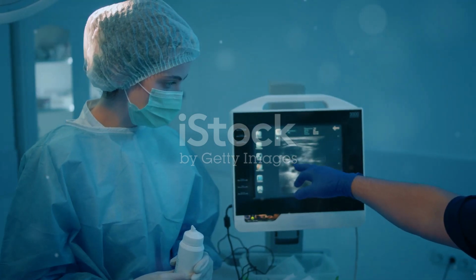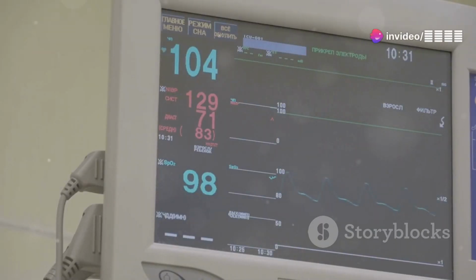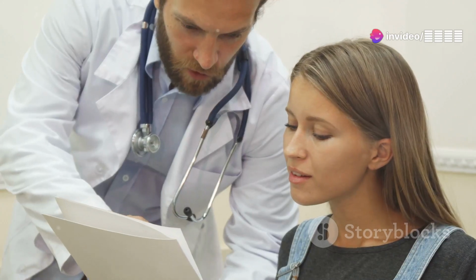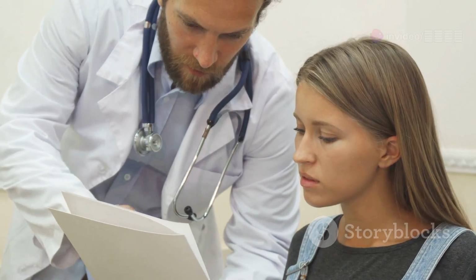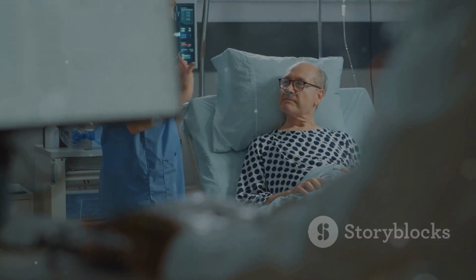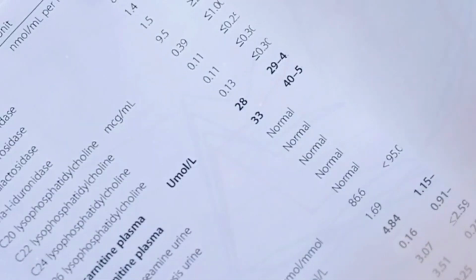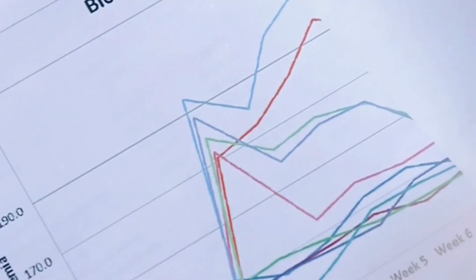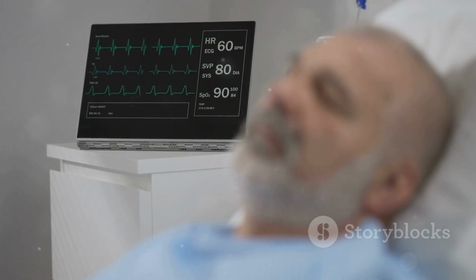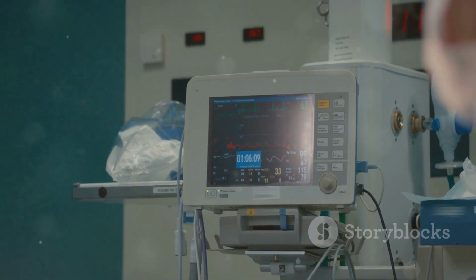Section 9. The power of ABG. Importance in patient care. ABG analysis provides a window into the body's respiratory and metabolic state. It plays a crucial role in diagnosing and managing medical conditions. By measuring gases and chemicals in arterial blood, ABG analysis helps assess respiratory function, evaluate acid-base balance, guide treatment decisions, monitor patient progress and track treatment effectiveness. ABG analysis empowers healthcare professionals to make informed decisions.